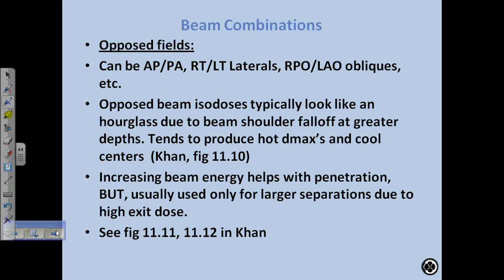Okay, beam combinations. So opposed fields. So we're going to just quickly talk about what isodoses look like for beam combinations. I keep looking at that time. We're going to try to wrap this up.